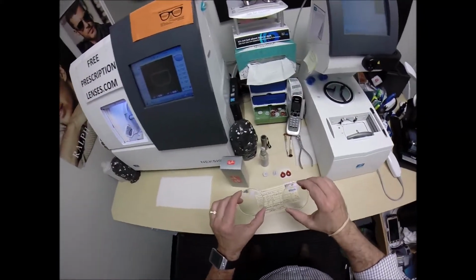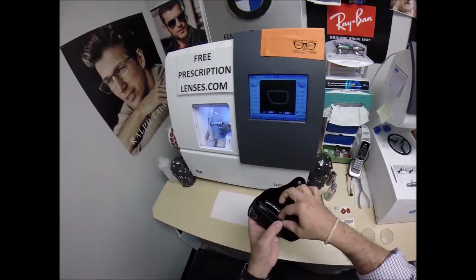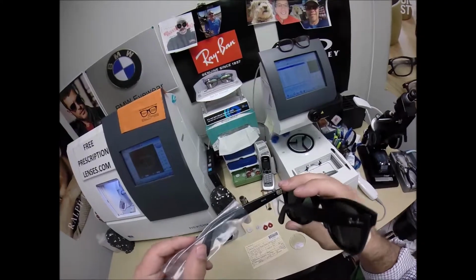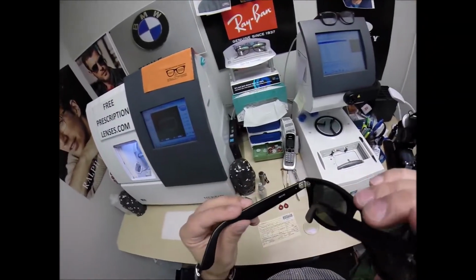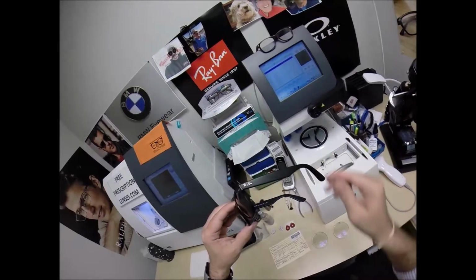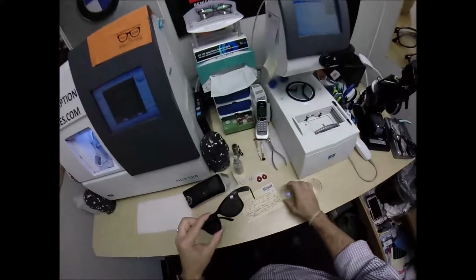I cut the Transitions XTRAactive Green with Crizal Easy for your RayBan 2140. Now, I cannot offer you this color, so you bought it from RayBan.com and mailed it to me. This is the matte black. Of course, it's the generic RayBan. It doesn't say anything because it's one of the ones you bought directly from RayBan, one of the custom color mixes. So nothing is written on the inside, just the RB 2140. But again, this is the matte black. I can get it in the shiny black, I can get it in the tortoise, and I think a couple other colors, but not this matte black. So he bought it, mailed it to me, and I'm going to cut the Transitions XTRAactive Green that hopefully will be the same color when I activate these lenses.